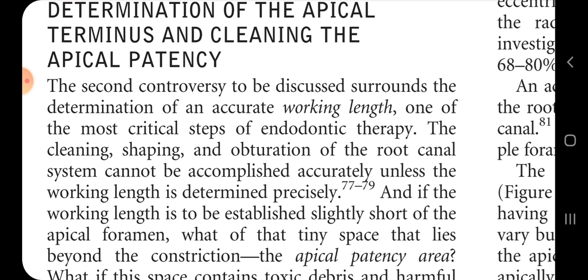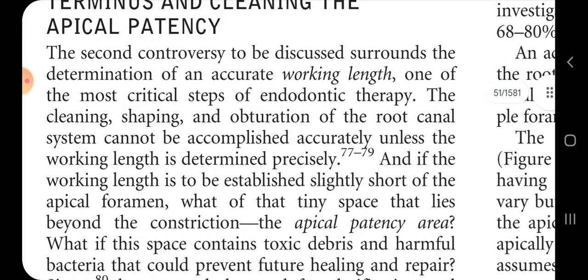And if the working length is to be established slightly short of the apical foramen, what of that tiny space that lies beyond the constriction, the apical patency area?